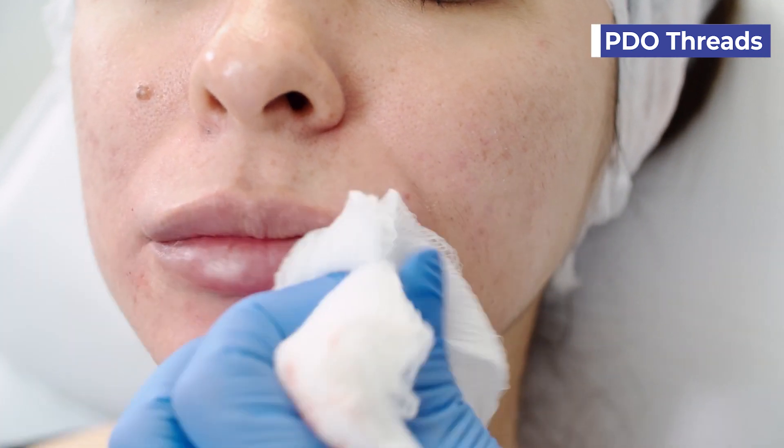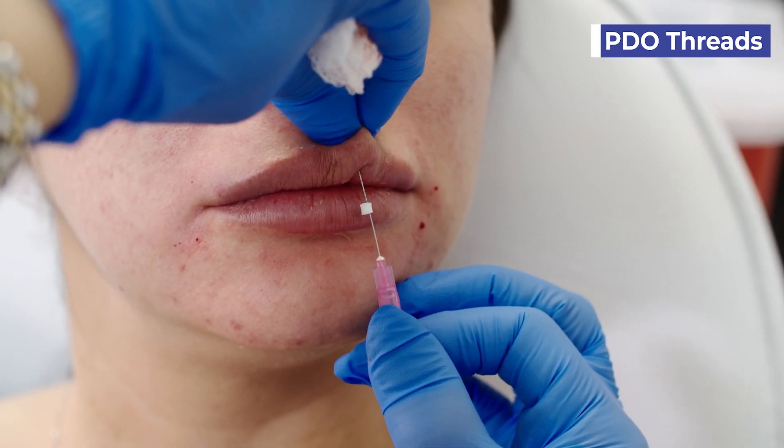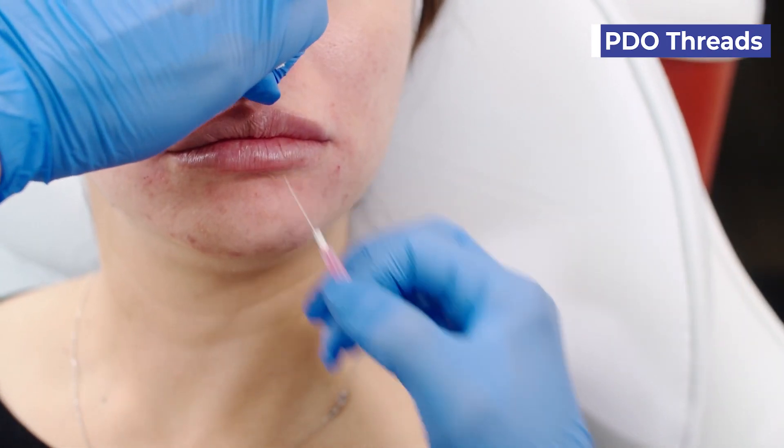That was to give a little bit of structural support. Now I'm going to go ahead and put a thread for the philtrum. This is how we can combine PDO threads with dermal fillers, or we can use PDO threads alone. The beauty of PDO threads is that you can use them by themselves to augment, enhance, and define lips as well as cheeks — just using different threads for different areas, just as we pick different fillers for different areas of the face. The monofilaments I used were mono screws; you could also use mono smooth to augment the body of the lips, build the philtral columns, and provide oral commissure support.